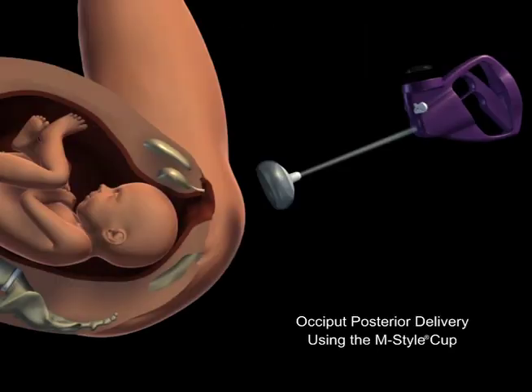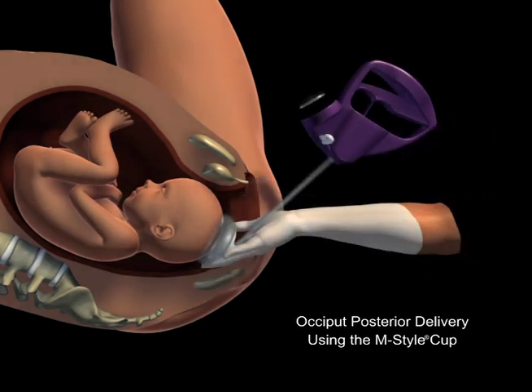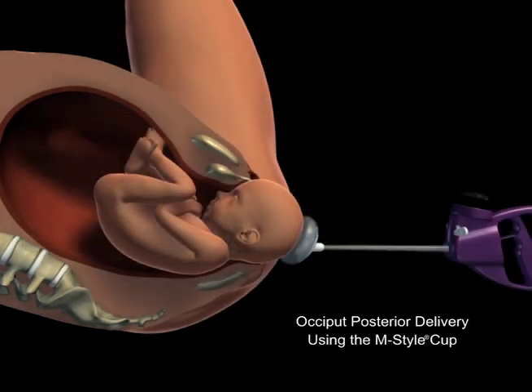During deliveries that require a higher traction force, such as OP deliveries, an M-Style mushroom cup selection is appropriate. These deliveries often require a flexible stem-cup interface to reach the median flexion point. Therefore, this cup's ability to be inserted smoothly makes it the right choice for all non-OA presentations.